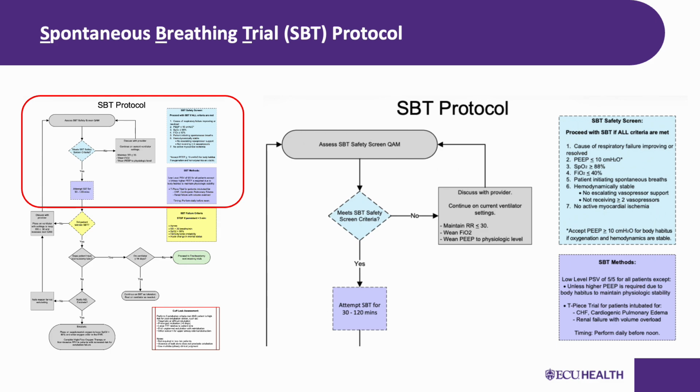Now, let me address something that comes up a lot: weaning parameters. If the trial lasts at least 30 minutes, you may perform weaning parameters like a NIF or rapid shallow breathing index if the physician specifically requests them, but they are not required per our protocol. And here is the clinical rationale as to why.